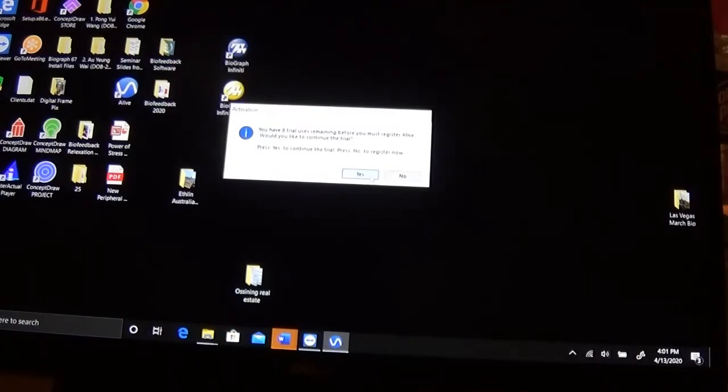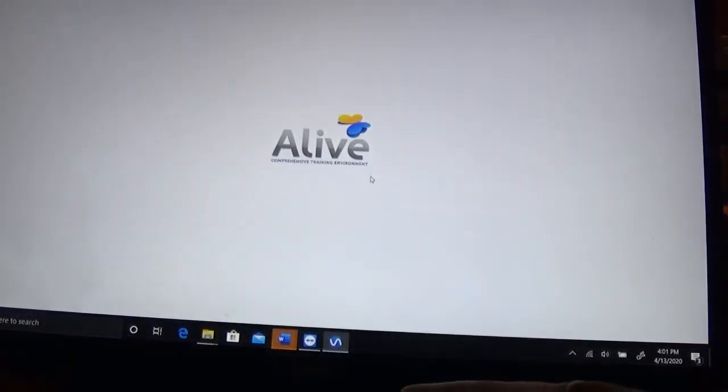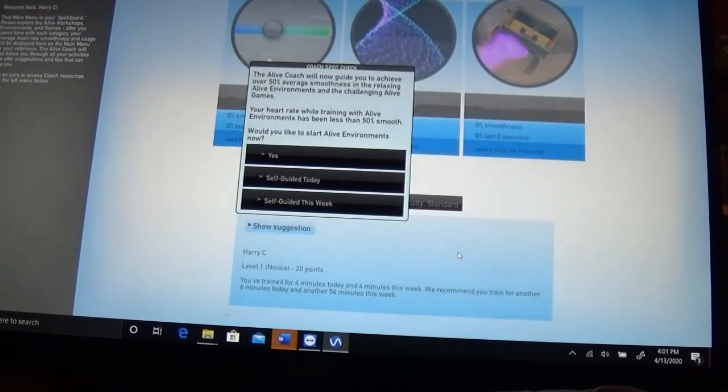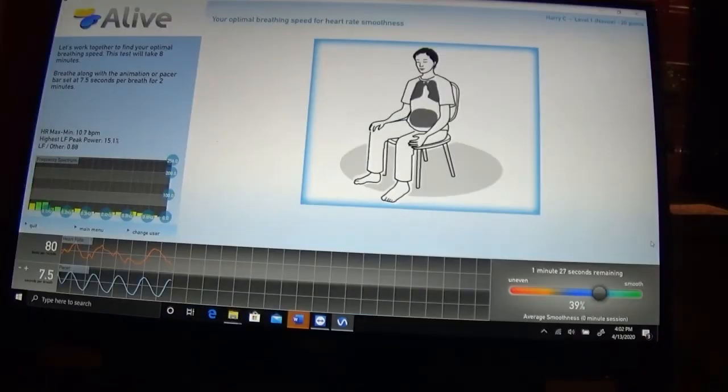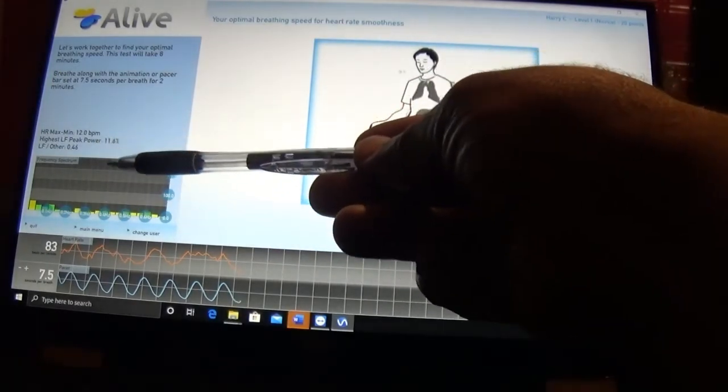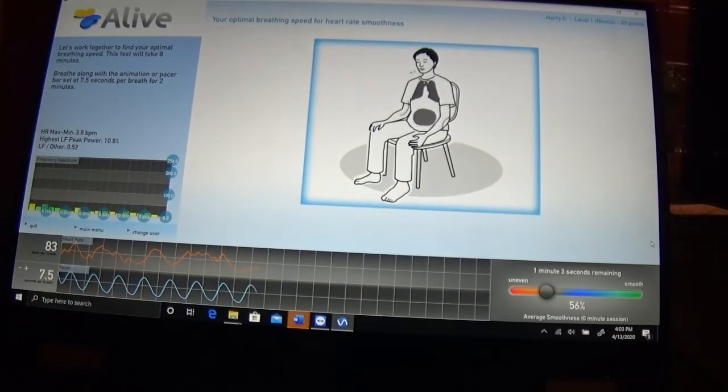So this is a screen that helps to find optimal breathing speed. You're supposed to breathe along with the pacer for two minutes at each breathing rate, and then it's going to measure the peak frequencies. Based on the highest peak frequency, that's the breathing rate that you would work with. So that's a quick demo of the Biosignals HS+.